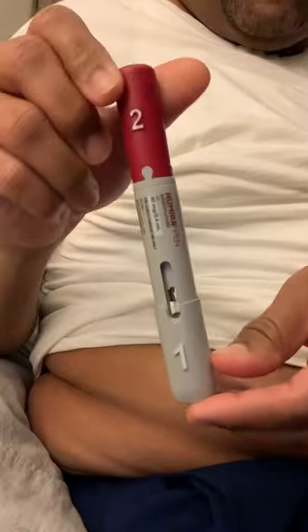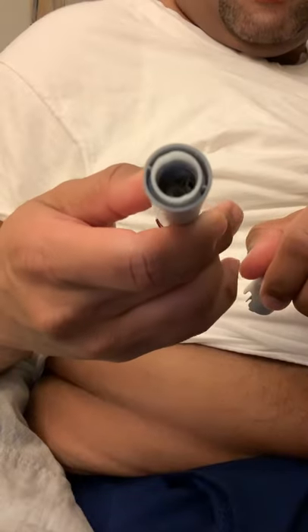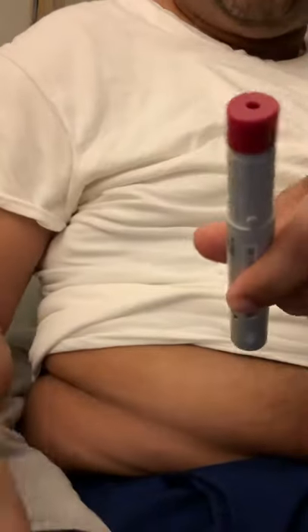The Humira comes in one and two. The first part is where the needle comes out — you can see the needle in there. The second part is the plunger.